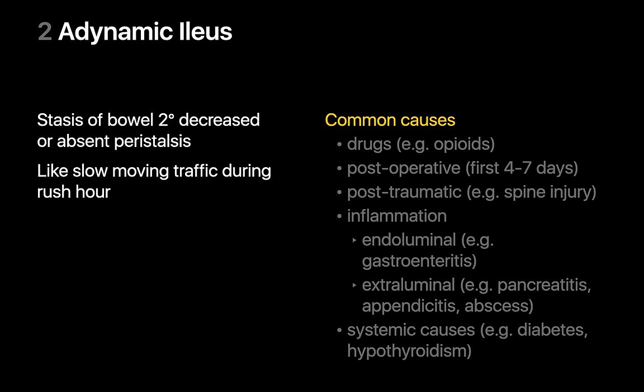Adynamic ileus has a different etiology from mechanical bowel obstruction and occurs when peristalsis in the GI tract has slowed down or stopped. Reasons why peristalsis is arrested may include narcotics, recent manipulation of the GI tract, trauma, inflammation of or near the GI tract, and sometimes systemic causes. Although the x-ray appearance of adynamic ileus may resemble mechanical bowel obstruction at first glance, adynamic ileus can often be distinguished since there shouldn't be a focal obstruction point with downstream GI tract clearance and collapse.